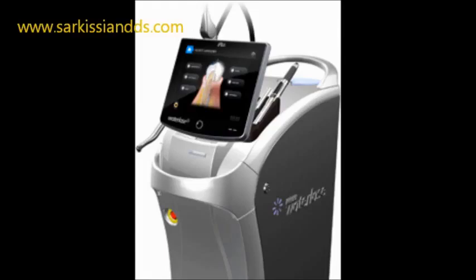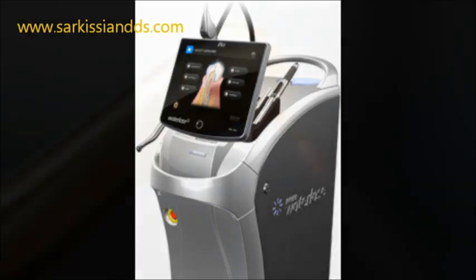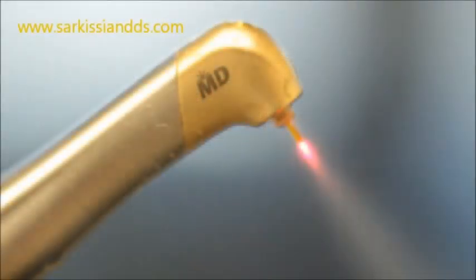The water laser is by far the best way to sever this band of fibrotic tissue. This is achieved with no burning, no cutting, and no suturing. Its healing time is much faster. A few drops of anesthetic is all that is needed, and it's a very child-friendly procedure.